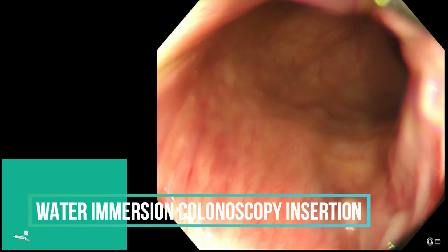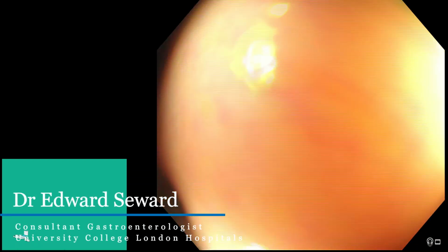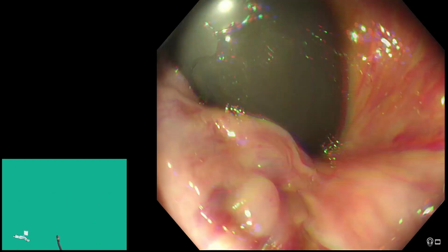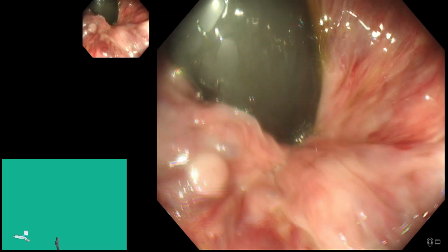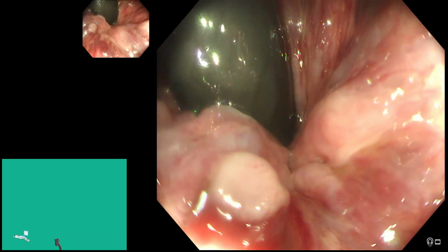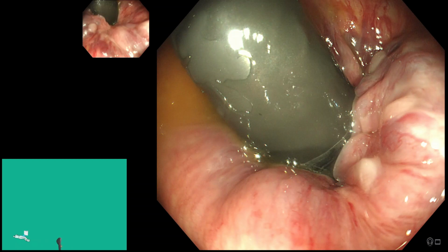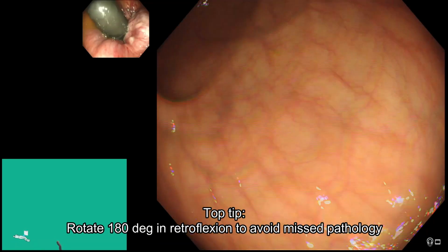First thing we do, we come back to the anal verge, and then we do big wheel down, and you do a sort of 90-degree turn, clockwise torque, just to view the rectum in retroflexion. And then I always go 180 degrees just to make sure we're not missing anything on the other side of the scope.